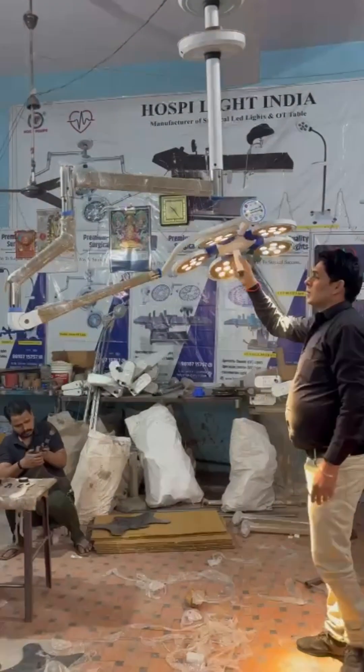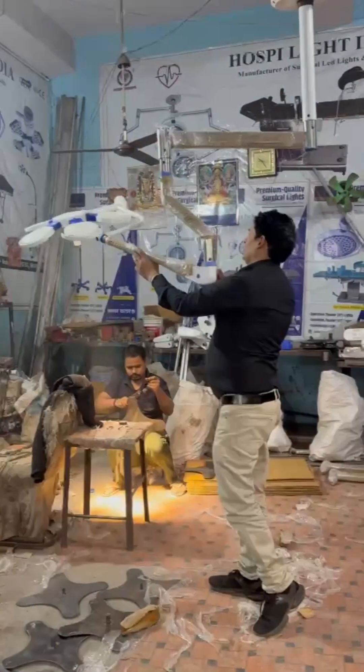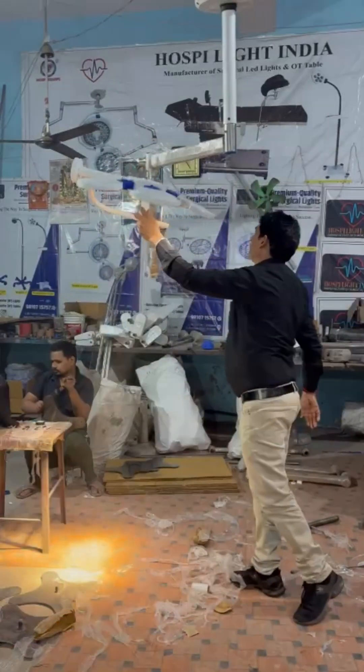LED OT light with 360 rotation. Based on this light, the light head can be rotated fully 360 degrees, providing maximum flexibility for different surgical positions and procedures.